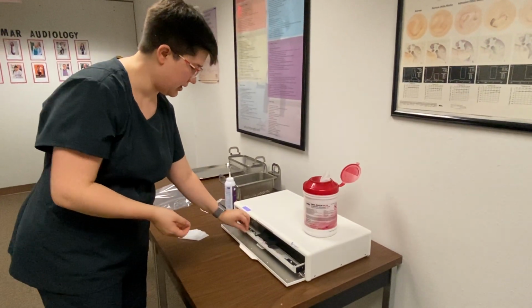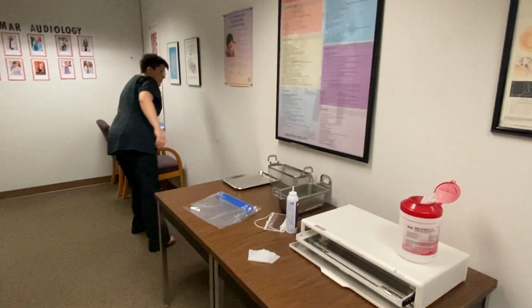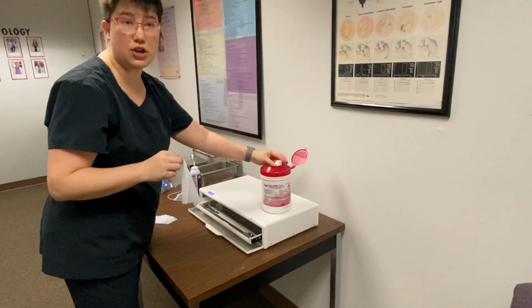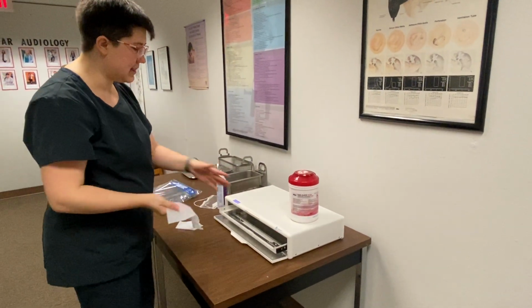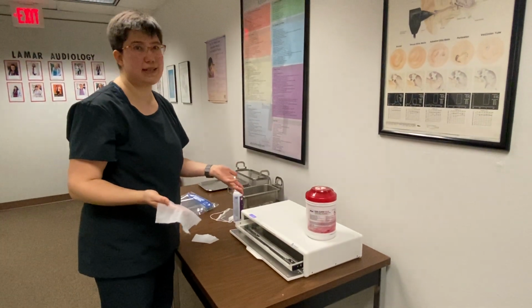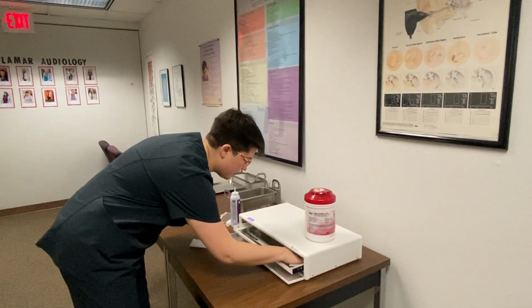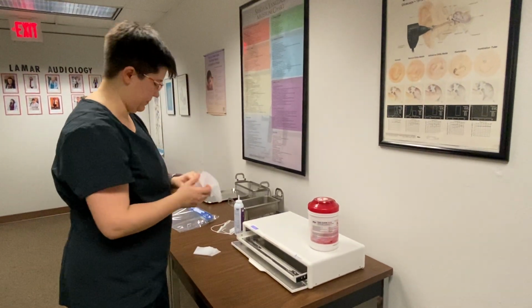The other thing to know about this is you don't want to put anything too dirty on it. You should pre-clean, as you'll learn with infection control, but this will get dusty eventually. So you don't need to use the big sterilizing wipes, but a wet wipe from the red canister used to gently wipe things down will work fine.